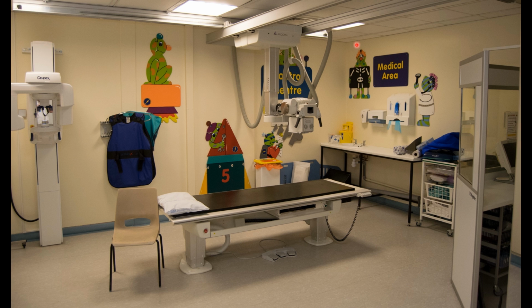So if you're wondering, an X-ray room can be lead-lined. They usually are lead-lined, but it is cheaper to have what's called barium sulfate plaster, which is also very, very good at absorbing X-rays. And anything that absorbs X-rays has a very high atomic number. The reason that we like lead is because it has an incredibly high atomic number, and it stops that radiation passing through. So here is what's called a Bucky table, or an X-ray table.